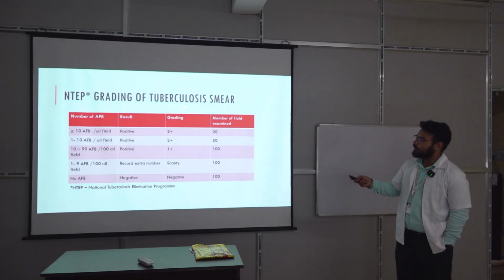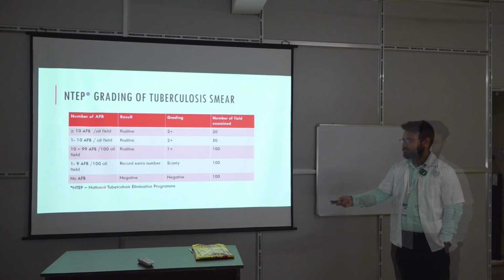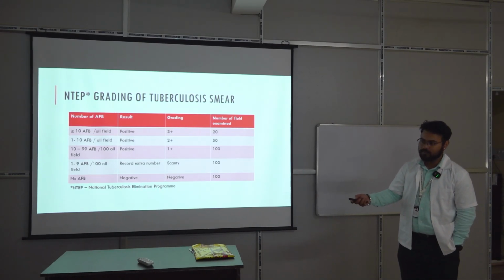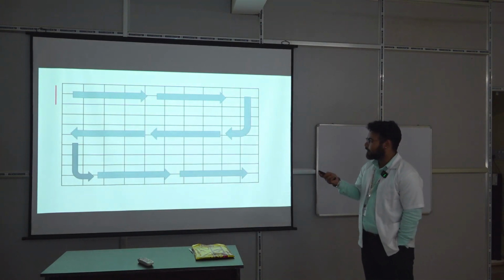This is NTEP grading of tuberculosis smear. What is NTEP? Okay. Did you read the comment? Okay, we'll learn it in class, okay.